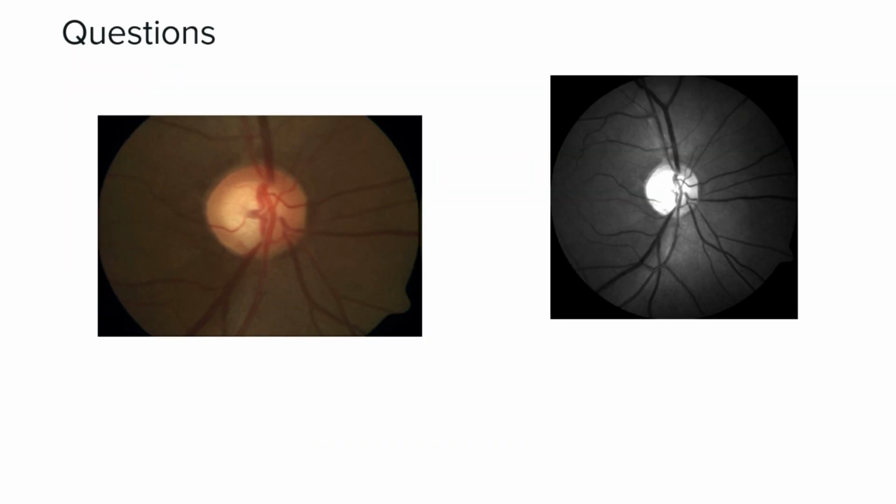Ma'am, this is an optic disc picture of the right optic disc, and it's an average-sized disc with neuroretinal rim thinning seen in the inferior quadrant, and there is notching in the inferior quadrant.